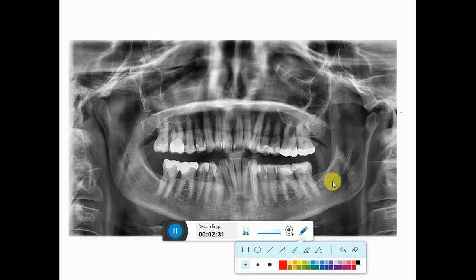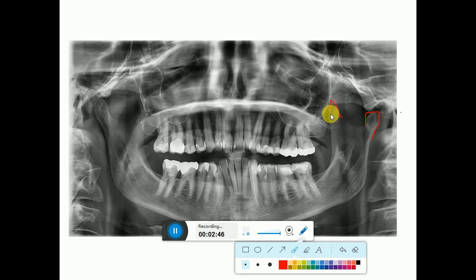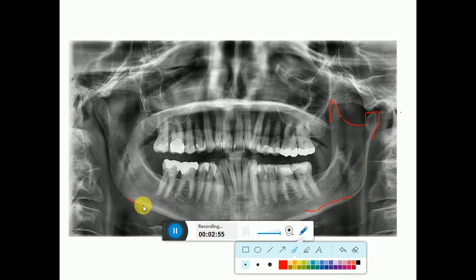Here we have the OPG. We can see this is the mandible and this is the maxilla. First of all, we have the condylar process of the mandible here, this is the coronoid process, and this is the sigmoid notch. This is the inferior border of the mandible — when there is trauma, we can see a step at the inferior border.